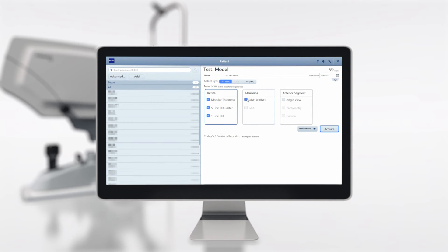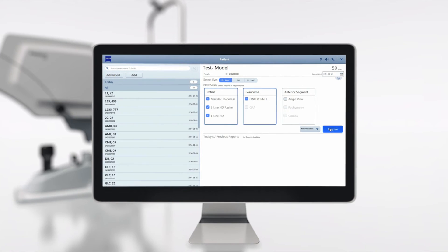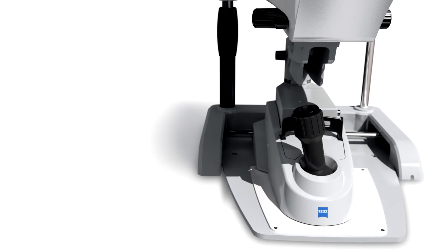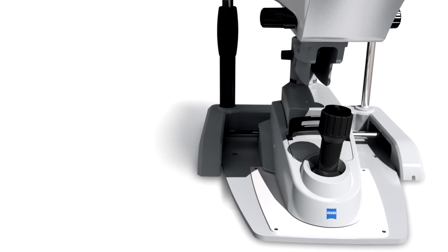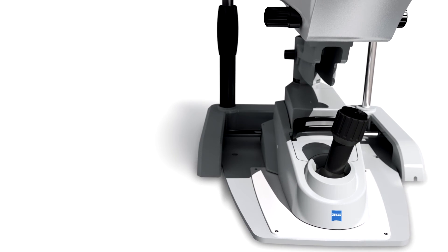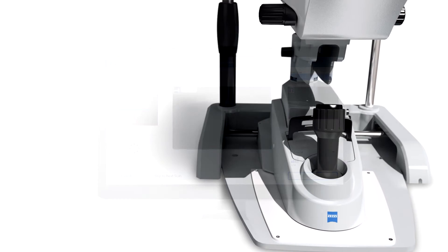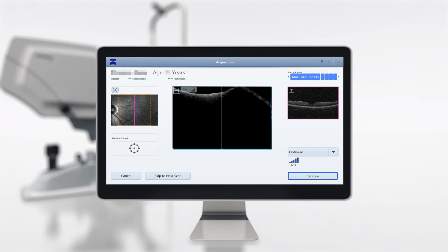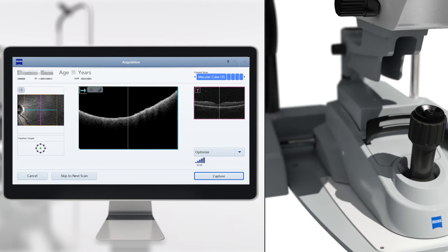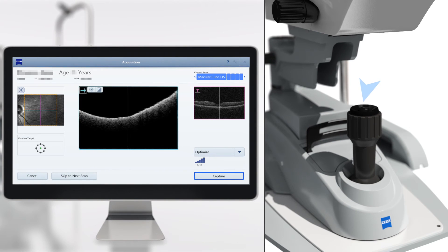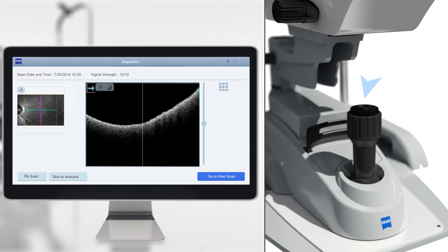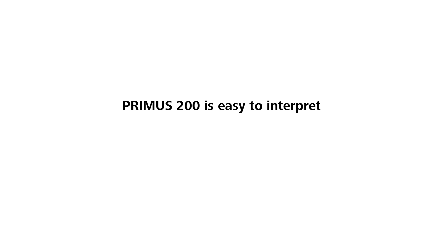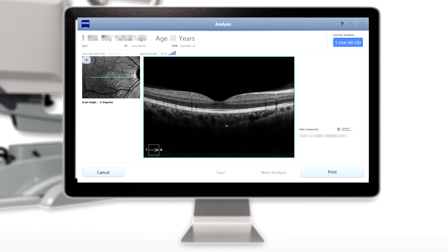Familiar joystick-based operation allows intuitive and fast patient alignment. Live confocal scanning laser ophthalmoscope fundus gives an intuitive feeling and clear visualization of where you are on the patient's retina. Primus 200 is easy to interpret. See the unseen with high-quality, easy-to-read images.